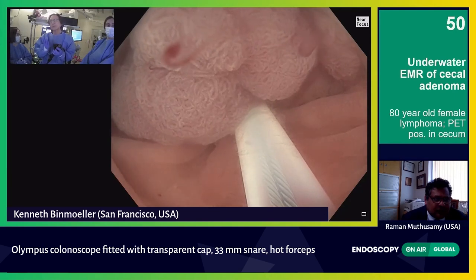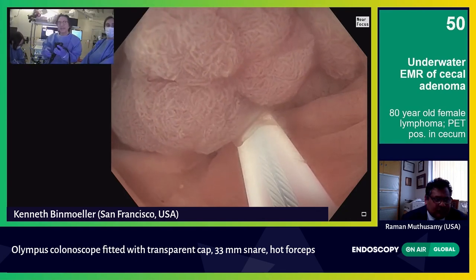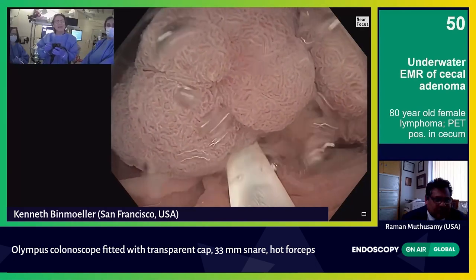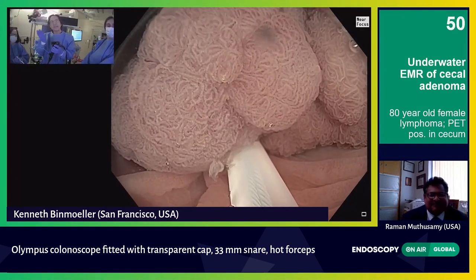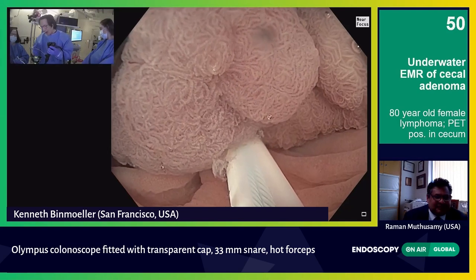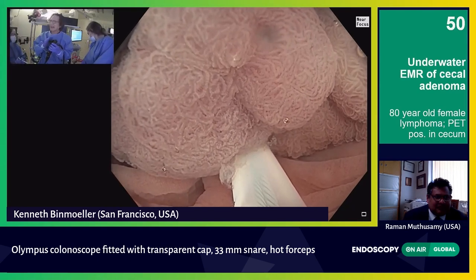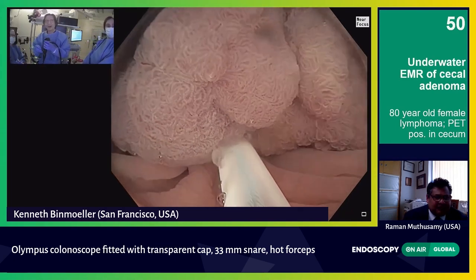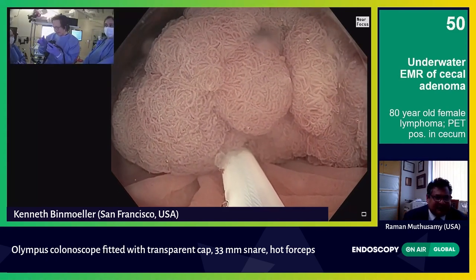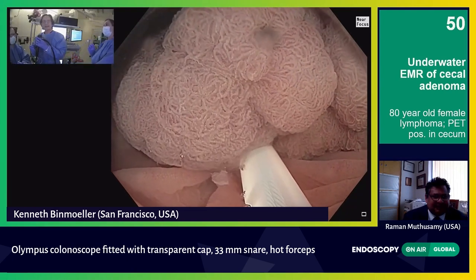I'm less concerned about thermal injury and perforation here due to thermal injury. Of course there's always a risk of perforation, but if you just move back and forth like this, it looks like it's moving very nicely — then it's a leap of faith. With EUS, this is how I started doing this: the muscularis propria stays round on the outside. I decided to use force coag because if I use auto-cut, even though that's my normal setting, I'm probably going to get bleeding. I may still get bleeding with force coag. I think we're ready now. My assistant is going to step on the water pedal so I get constant water flow. Let's go for it.